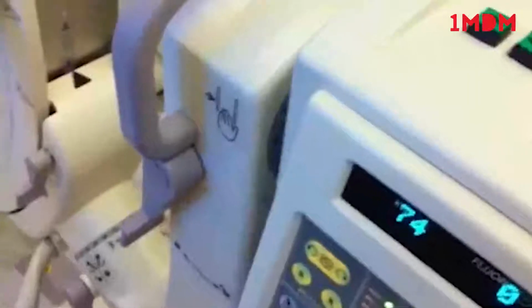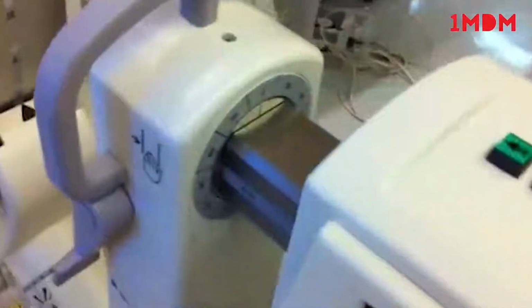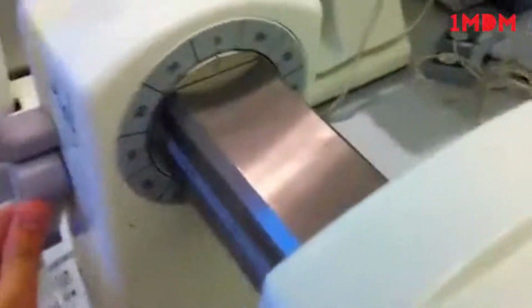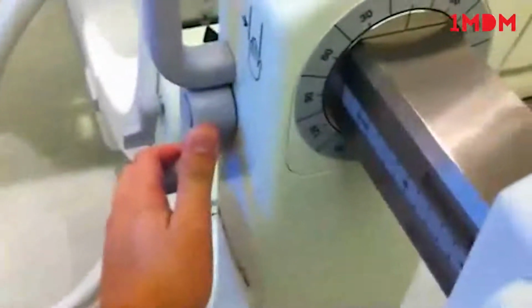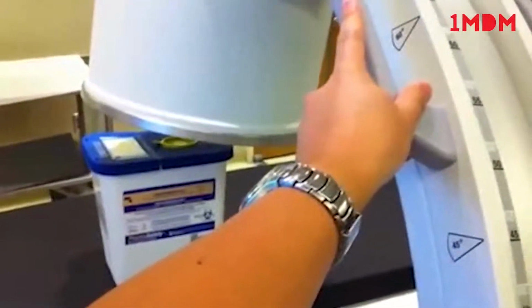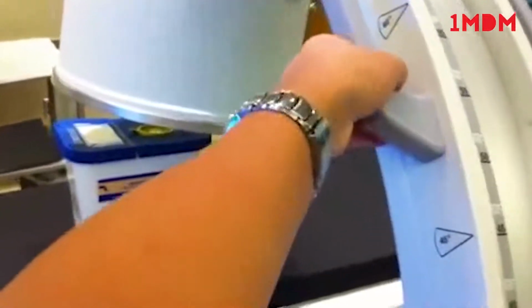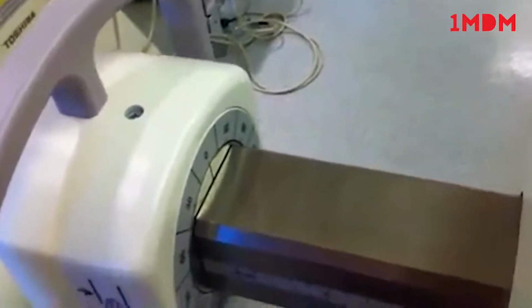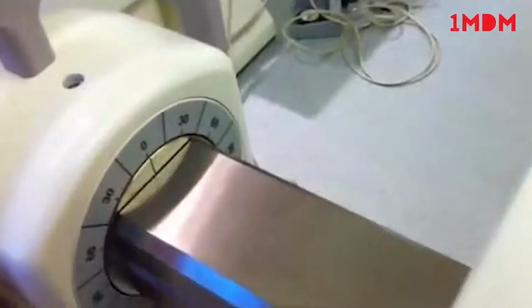And although you can't see it, if I push this thing forward, we have a tilt function here. Basically, you can make caudal or cranial tilts. So if I unlock this right here, I can actually grab the C of the C-arm here and push it down for basically a caudal tilt, or turn it this way for a cranial tilt. Okay, here we go. And it's very close to 0. There we go. Let's lock it now.